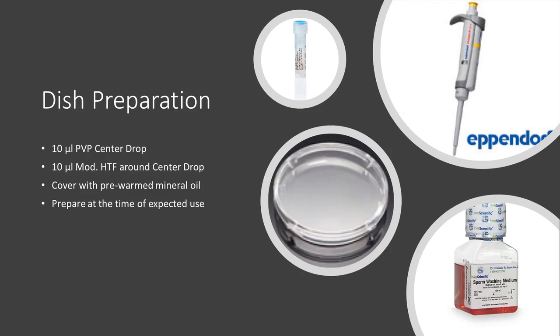I show in this slide the sperm wash media, to represent how I personally use sperm wash media for all micromanipulation procedures. A sperm wash is simply modified Hepes buffered media, pre-supplemented with protein at 5 to 10 milligrams per mL. It's just easier for me to have one media for all washes and ICSI.